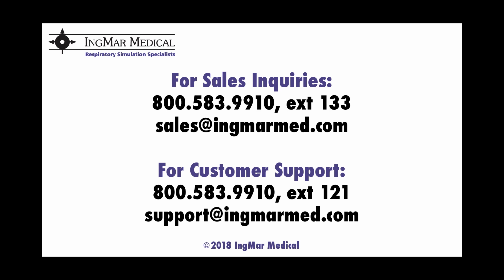If you're having an issue via COM port, via USB RS-232, we want to ensure that that COM port is correct in order to connect to the ASL 5000. The other thing you want to ensure is that for older ASL 5000s you are connected to the host port on the back of the ASL 5000. Newer ASL 5000s, there's only one port to connect to.